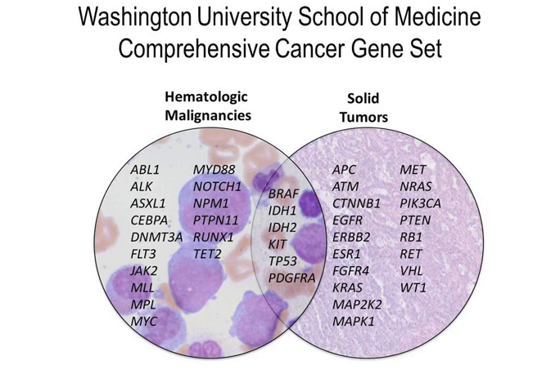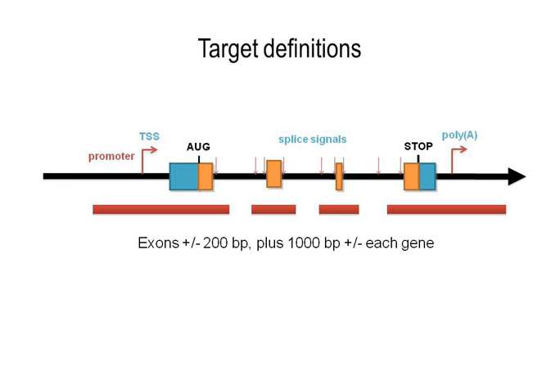So this is just to give you a background on what NGS assay we use in our lab. We have a panel of about 50 genes. The genes are listed here, and we have been doing next generation sequencing for over 3 years now, and the subset of genes are responsible for heme malignancies as well as solid tumors, and there are obviously some common genes which are responsible or causative in both the tumor types. So this is how we design our NGS panel.